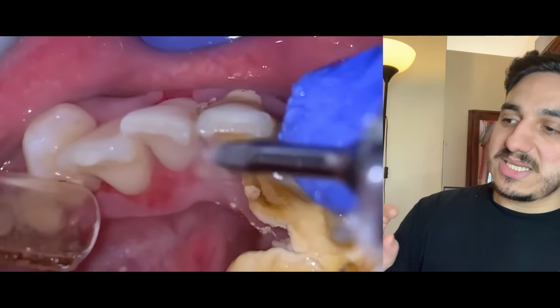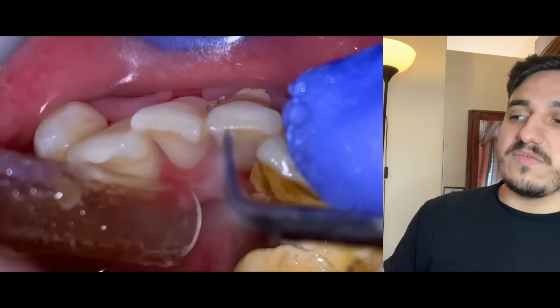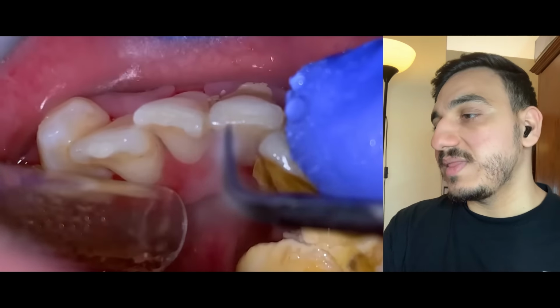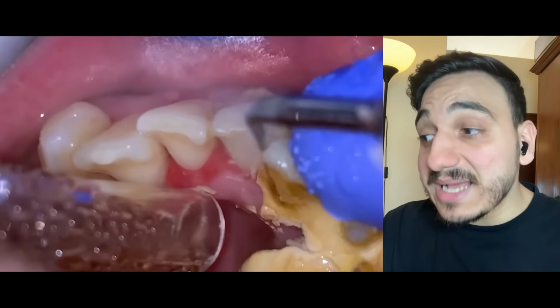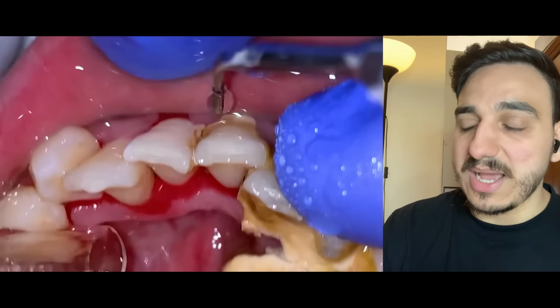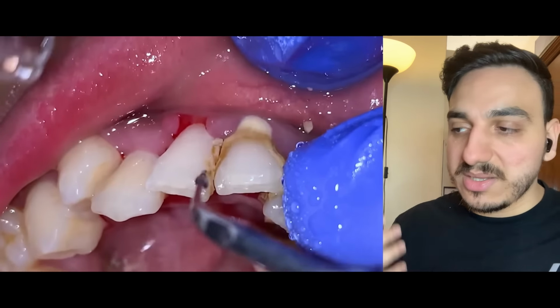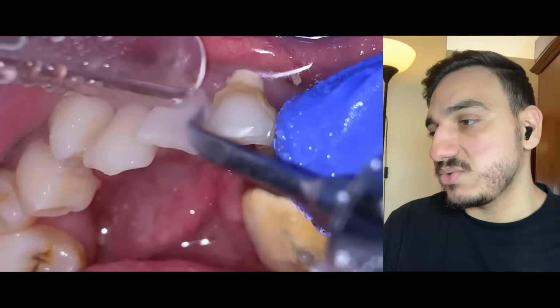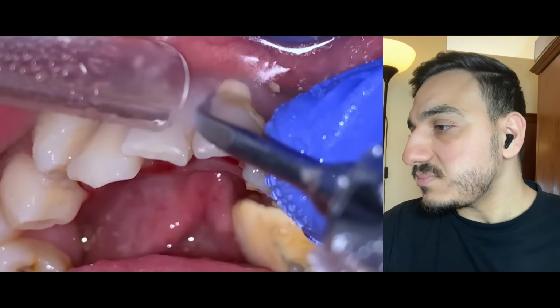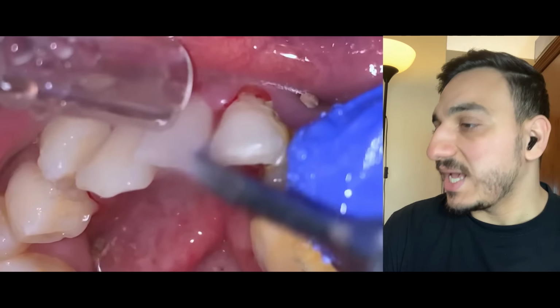As you can see, the ultrasonic scaler can also be useful in removing certain stains on the teeth, enhancing the aesthetics, because even a person like this who has crowding and a lot of dental clutter will be concerned with aesthetics as well. Because they're human, and humans are conscious about their smile and dental aesthetics.